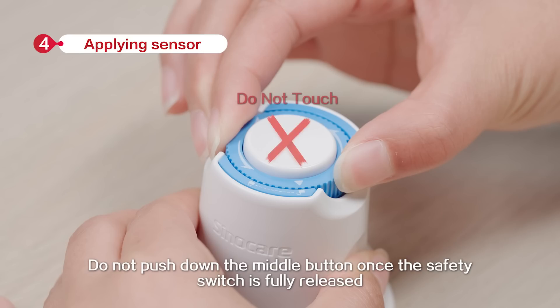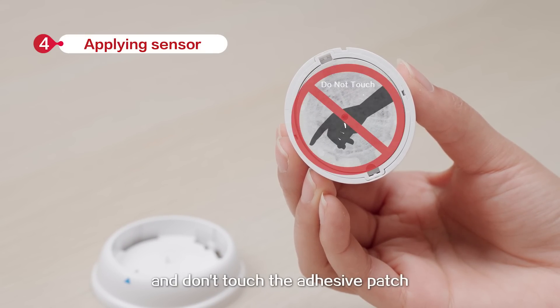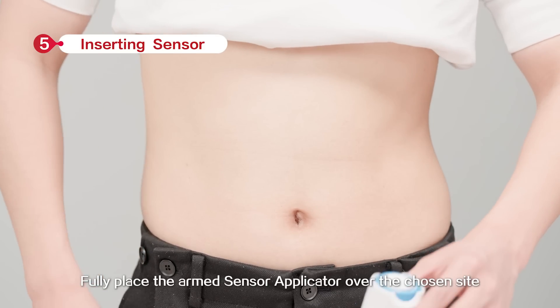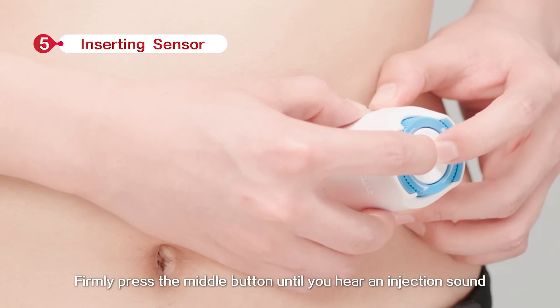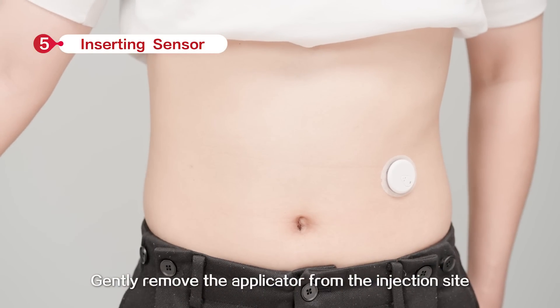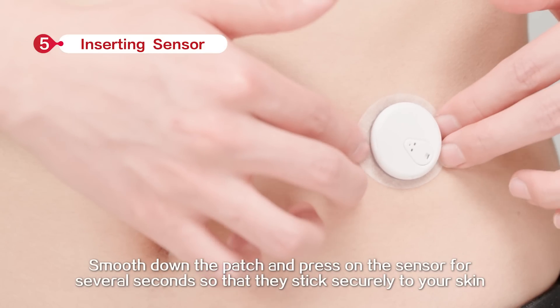Do not push down the middle button once the safety switch is fully released. Gently and vertically lift the armed sensor applicator and don't touch the adhesive patch. Fully place the armed sensor applicator over the chosen site. Firmly press the middle button until you hear an injection sound. Gently remove the applicator from the injection site. Smooth down the patch and press on the sensor for several seconds so that it sticks securely to your skin.